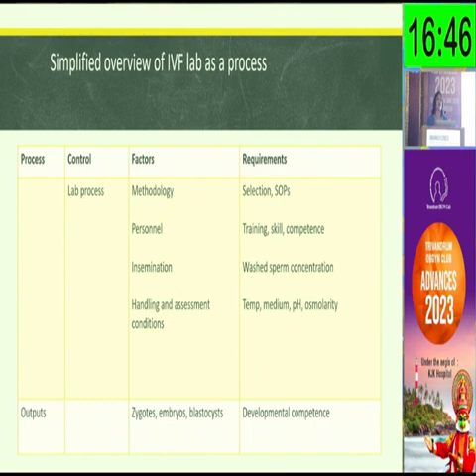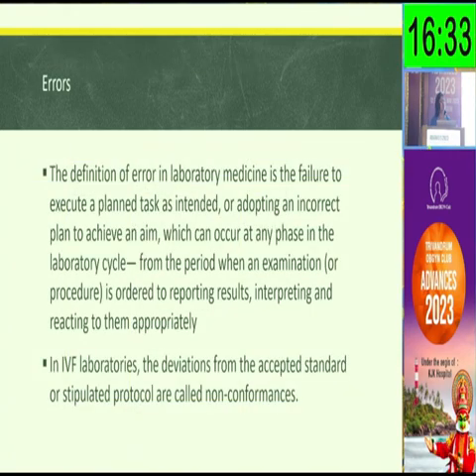And the lab processes, from the pickup, the selection, the ICSI, the IVF, and transfers, freezing, everything included. The entire process plays a part, and each of these processes that we have broken down needs to be assessed when we are looking at troubleshooting.